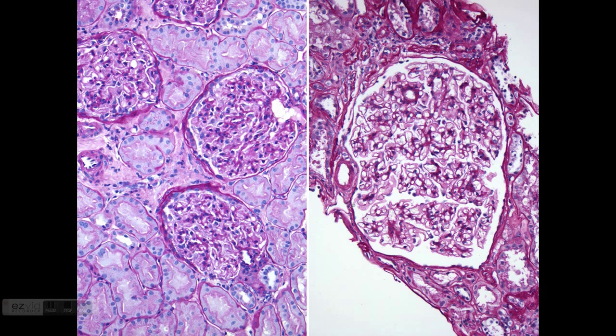So the first adaptation would be enlargement or glomerular hypertrophy. You see here several normal glomeruli to the left, and then you have this huge, giant glomerulus to the right. It's probably 2 to 3 times bigger than normal.